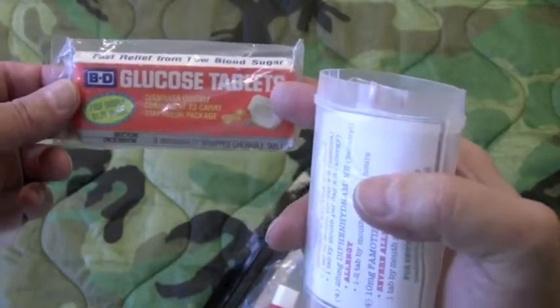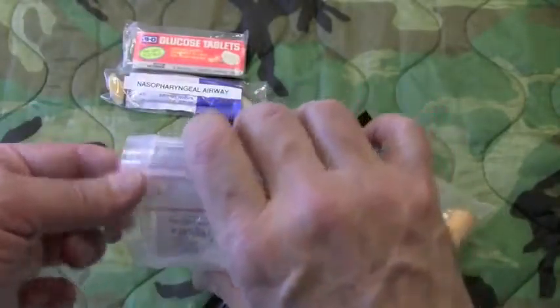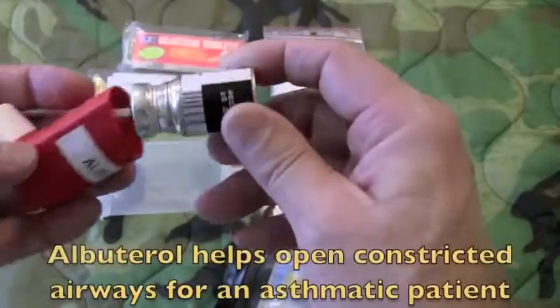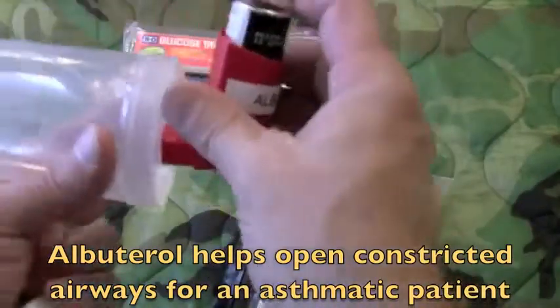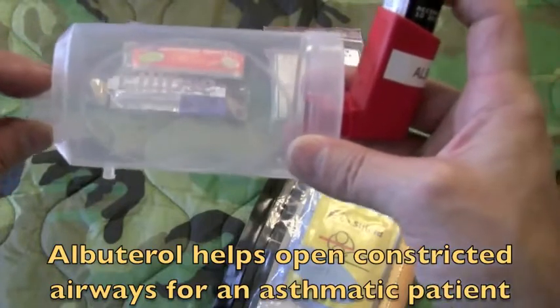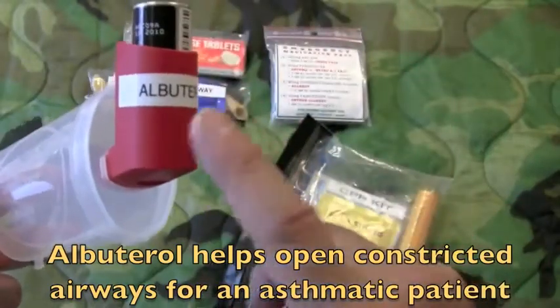In this container, which is a spacer for an albuterol inhaler, is a medication pack. There are also glucose tablets to deal with diabetic emergencies, primarily for someone who has too low blood sugar. Then there's the spacer that goes with an albuterol container and a dispenser that sits on the end of the spacer. You shake it up, two puffs, and the patient breathes from this end. Anybody having an asthma attack and doesn't have their medications will be glad that you have this albuterol with you.